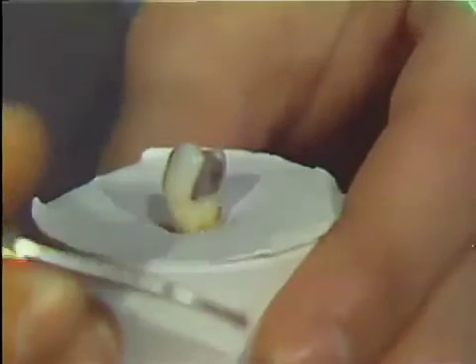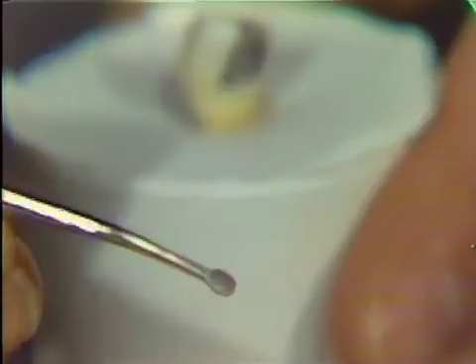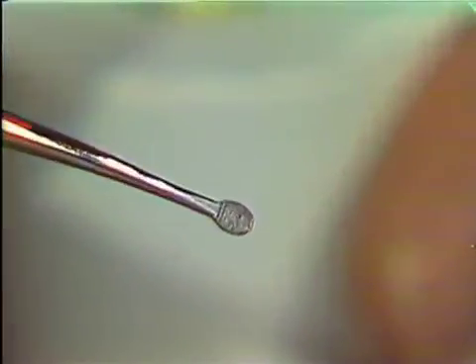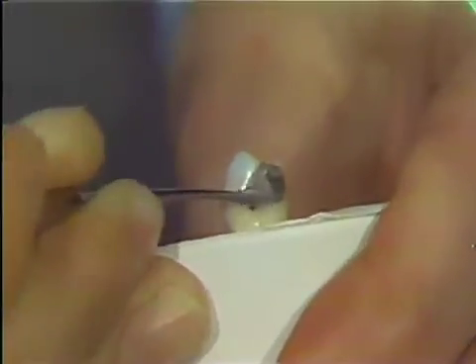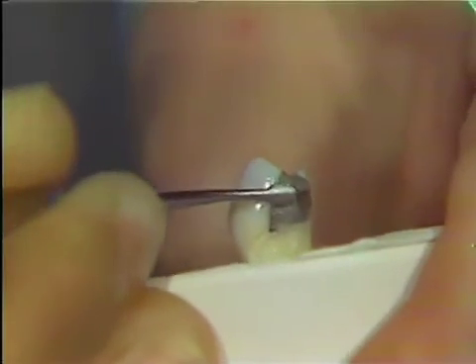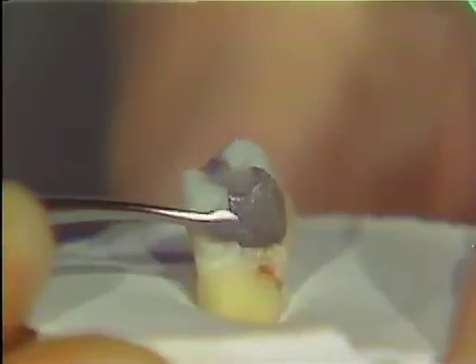The Rhein trimmers are paired instruments, and they are used primarily on the buccal proximal and lingual proximal margins of class twos. If we get a close-up of the instrument, you can see that the head of the instrument is much like the periodontal files used in clinic. This instrument is used with a pull stroke to smooth margins. It can also be useful in removal of overhangs.